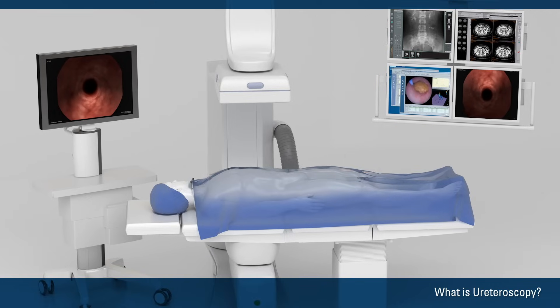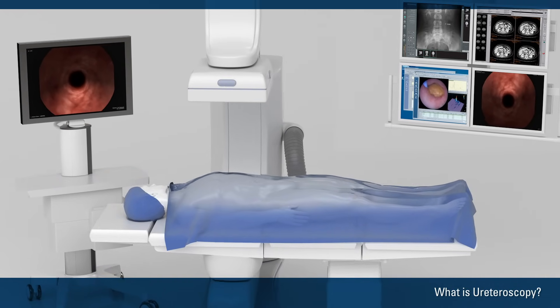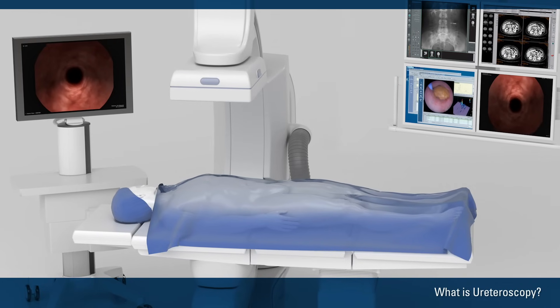The procedure typically requires anesthesia. However, the doctor does not make any surgical cuts or incisions on the outside of your body.